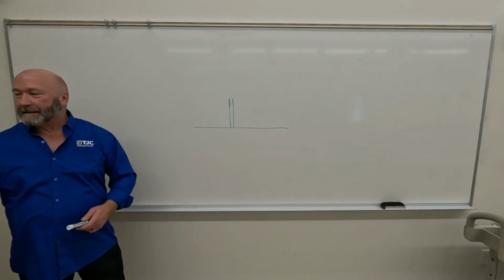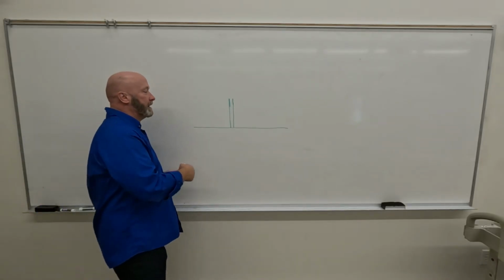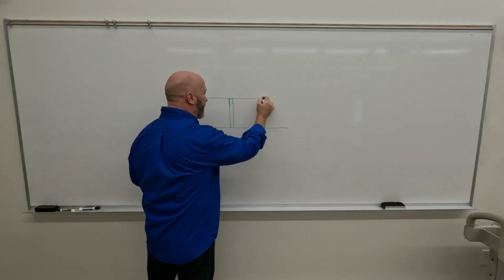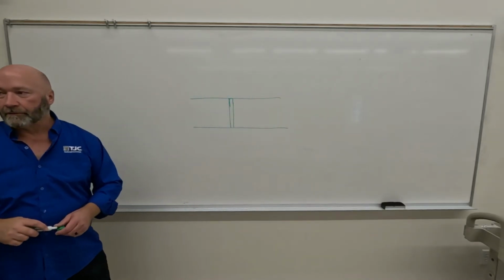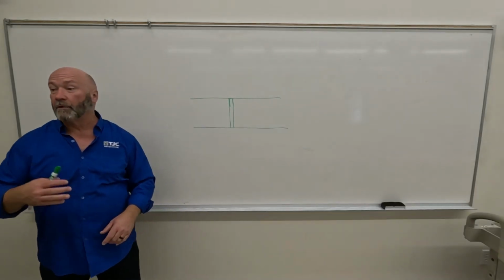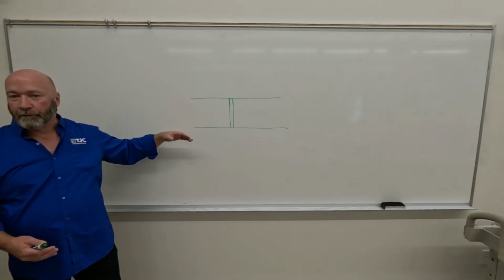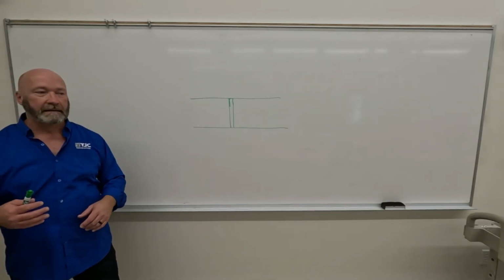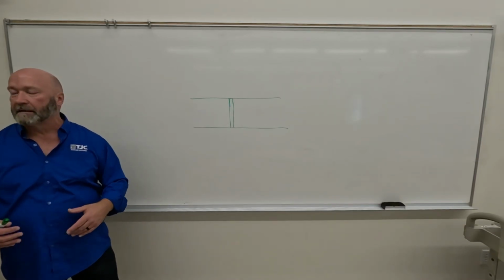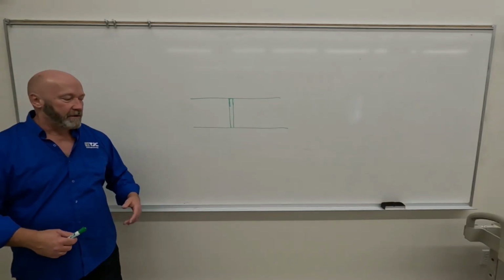So what is in the textbook is ceiling to floor mounted system, so that instead of just having it on a track, it's got a track up top and a track on bottom. Otherwise it's identical, really. It's got the crane system, but it's got a support at the top and a support at the bottom so it won't fall over. But it's still very limited. Both of those you're only going to see in a doctor's office, somewhere that they don't have the deep pockets in a big building like what you're going to see in a hospital. Okay, so you don't see a whole lot of those.